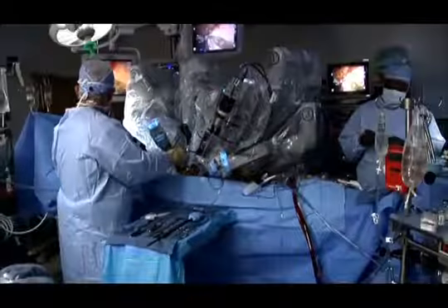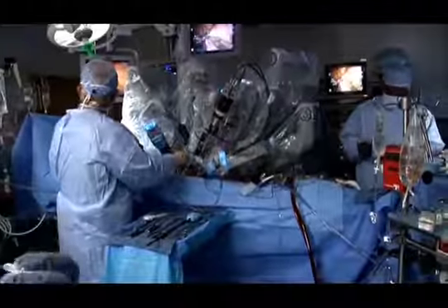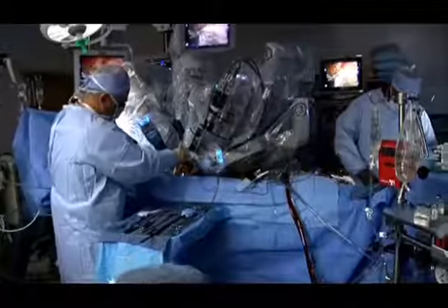Well, it's actually a lot easier. They've called the company Intuitive because that's exactly how it is when we use it. When we actually move our hands, that is how the instruments move inside of the body. In traditional laparoscopy, if I want my instrument to go to the left on the outside, I'm actually moving my hand to the right. So it's counterintuitive, versus now the instruments move exactly as our hands are moving at the console. An additional benefit to surgery with the Da Vinci is a lower risk of post-surgery infection.